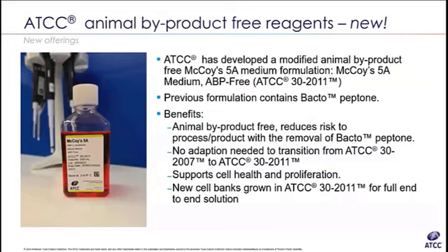Both cell types are really sensitive to stimulation. So typically, in my experience, you grow the cells in the defined media needed for each cell type separately. And as you approach the actual co-culture point, you take off those additional additives, the stimulants, and you go to a more simple, basic media. It's going to be required to be optimized, and especially if you're using primary T cells, the performance is going to be donor to donor. Some are going to be really tricky. Some might be a little bit steady eddy. So all of that to say, it depends.